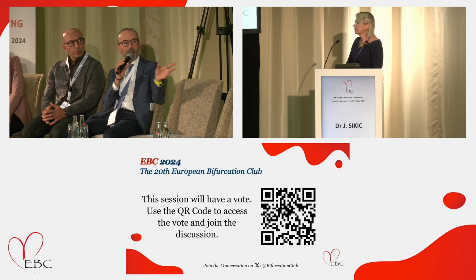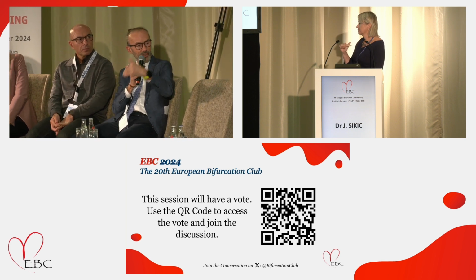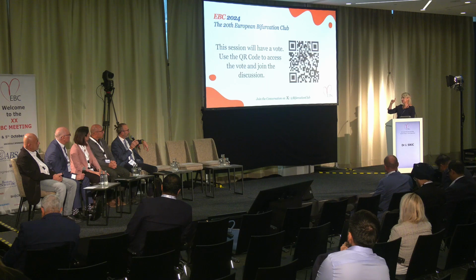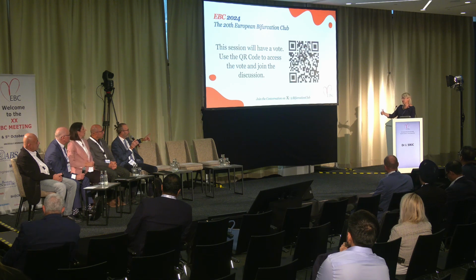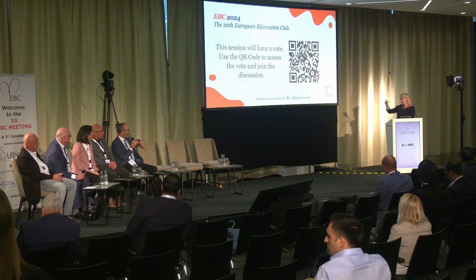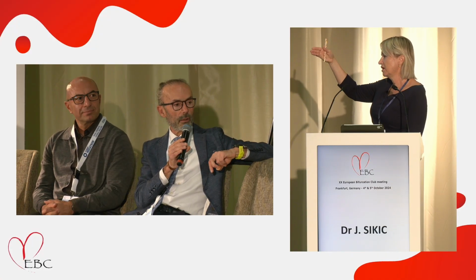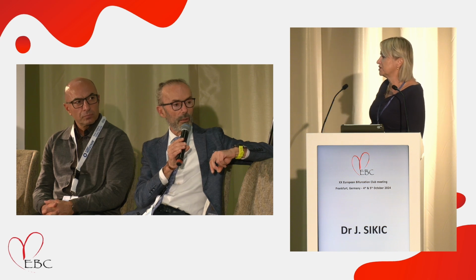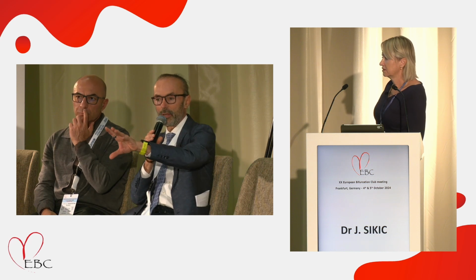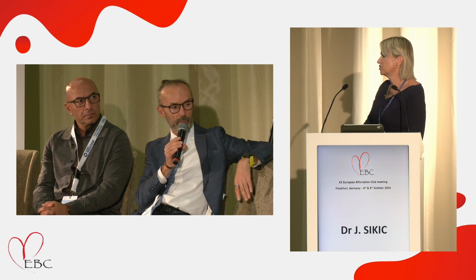No. Because I see a long stent from left main to mid-LAD. So you stented up to after the diagonal. No, that was one stent. So that was a calcification. I put the stent from left main to the LAD. That was one stent. Where, the mid-LAD or proximal? The mid-LAD was calcified, so it looked like a stent. It's not a stent. And this bifurcation between the diagonal branch and the LAD was treated only with the DCB. Only with DCB? Yes. Because at the end, in the images, it looked like there was a stent also across the diagonal. No, it's just one big stent.